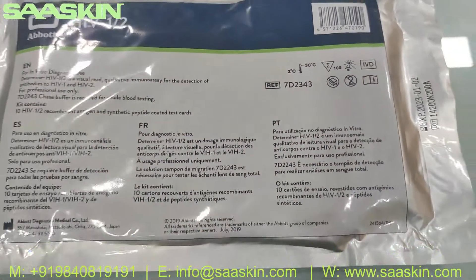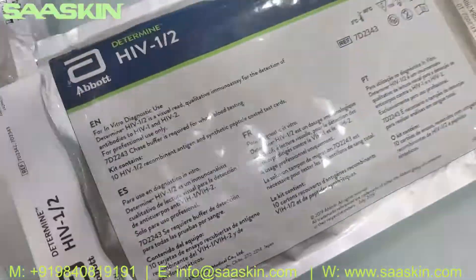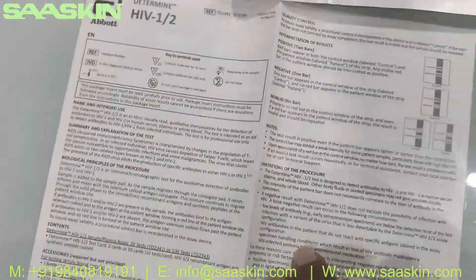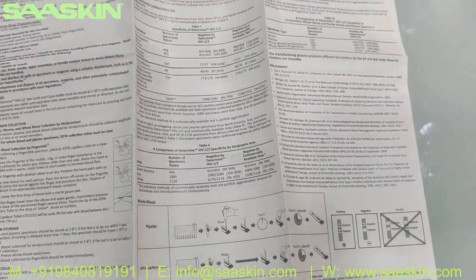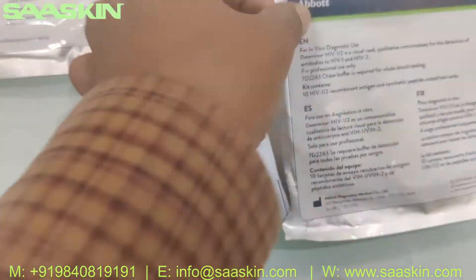I'm going to open the pack now and show you the contents inside. Inside you've got an IFU brochure with complete and very detailed instructions for the Abbot Determine HIV 1/2 test. The brochure covers testing procedures, interpretation of results, and all complete details.